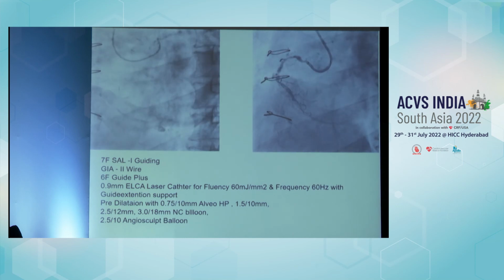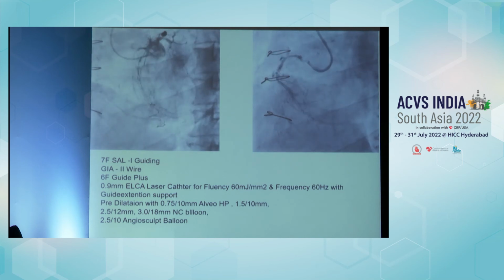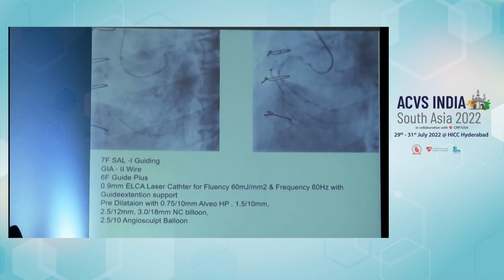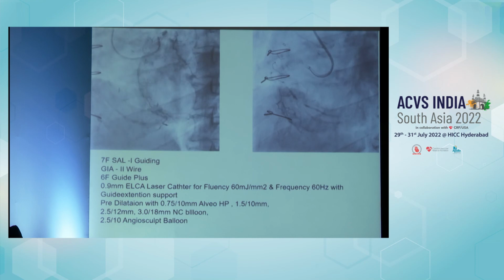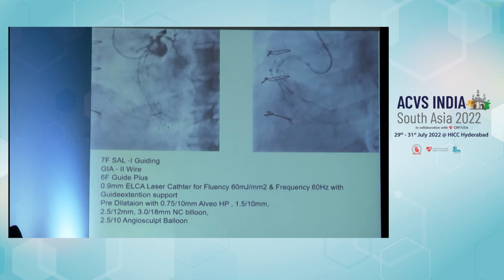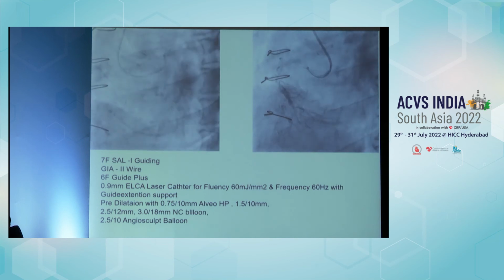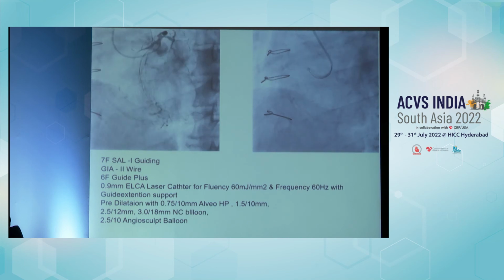Again I'm telling you, with the laser catheter we could not completely exit the tight lesion. We spent a lot of time in the lumen, and that definitely softened the nearby areas also. So it's not that you need to pass through and through with the laser catheter to get a fantastic result. After so many fluence and burns, we couldn't pass the catheter totally, but that definitely allowed all the balloons to go.